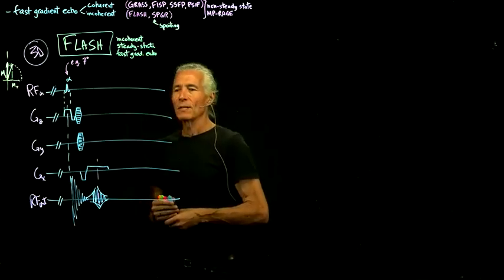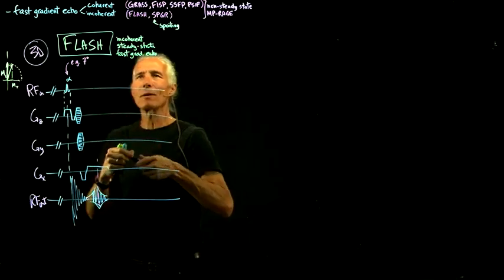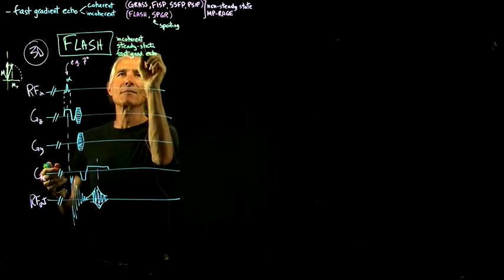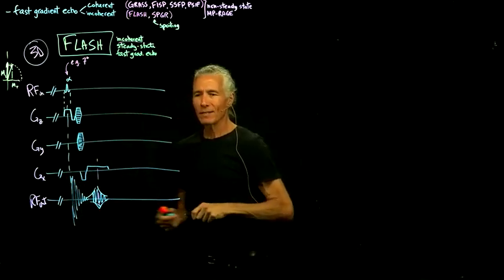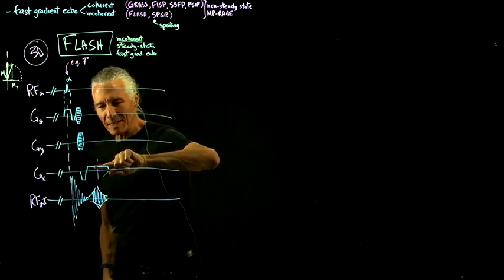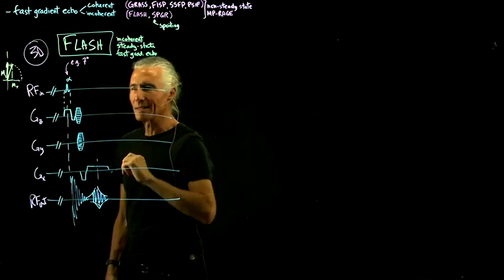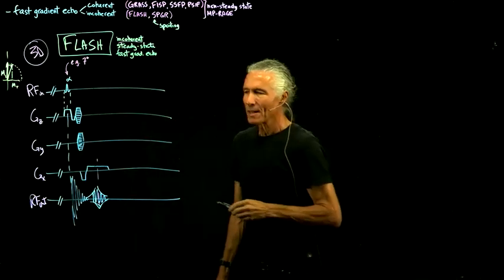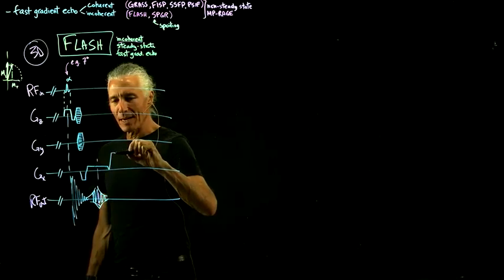And so now the incoherent part. How do we mess it up? The two main things that we do. One way of messing up some leftover magnetization is we can dephase it. And so what we do is we put some gradients on.